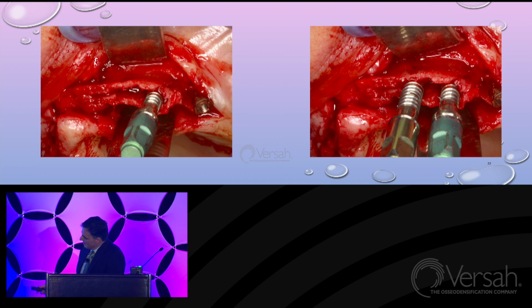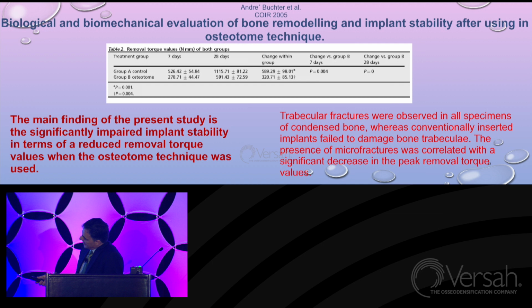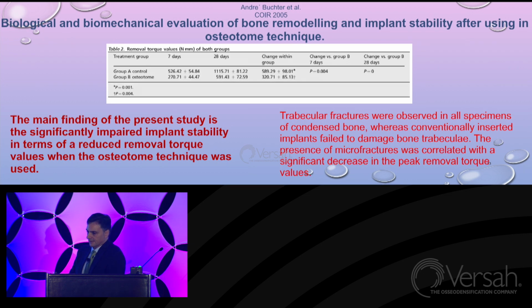Let's focus on some papers. We have papers on this preparation technique, many papers published, some on animals, some on humans. Just a short note on this paper, which is basically a histological and biomechanical evaluation at 7 days and 28 days. And the main finding of this study is that there is a significantly impaired stability in terms of reduced removal torque for the osteotome technique.